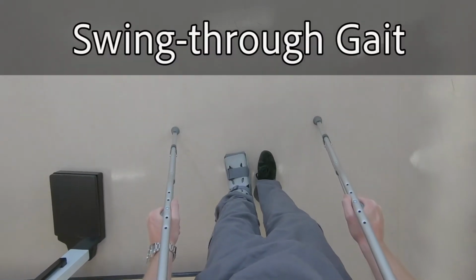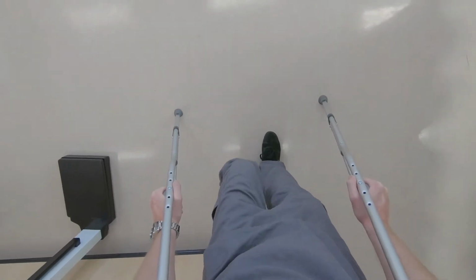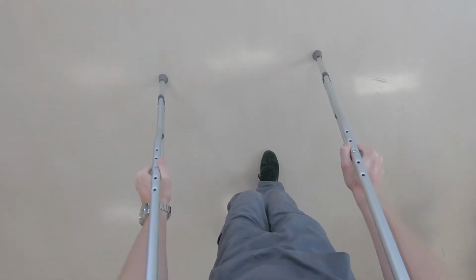Another variation of the 3-point gait is the swing through gait, where you advance both crutch tips forward and then swing through past the crutch tips. This type of gait is more advanced and requires a high degree of coordination.